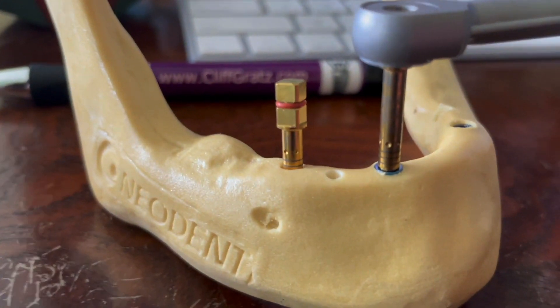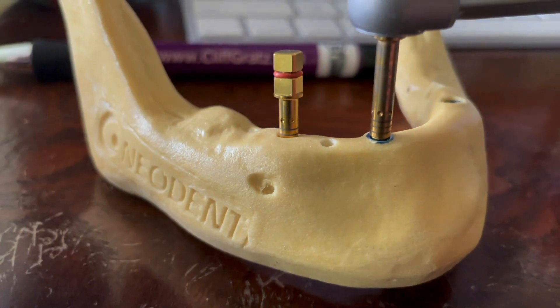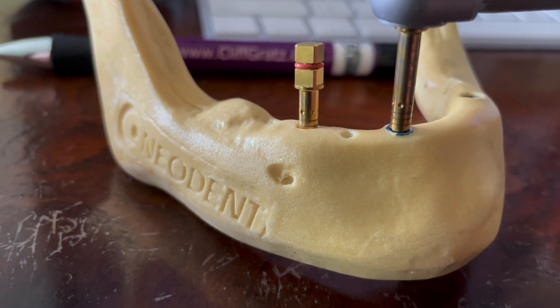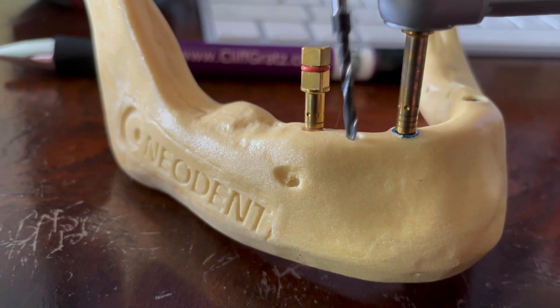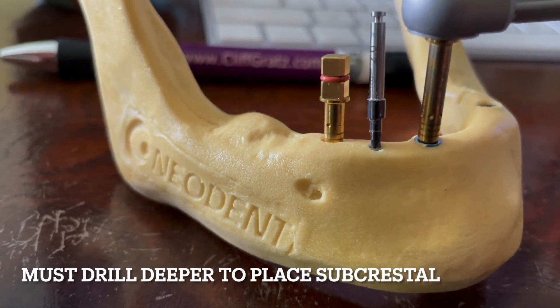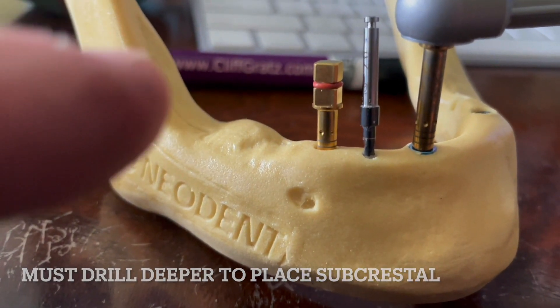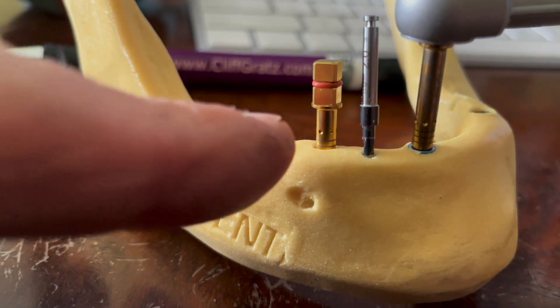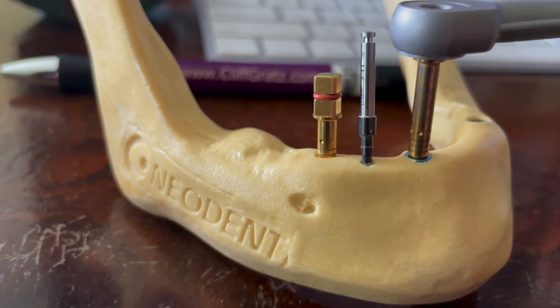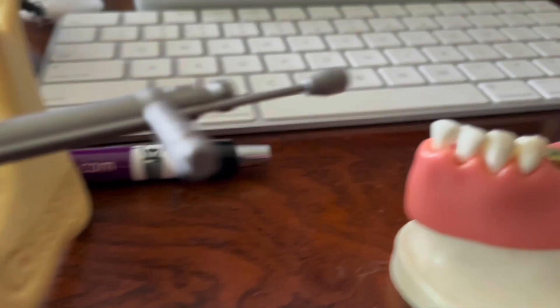Keep in mind, when we're talking about sub-level crestal placement, we've got to make sure that we're talking to our doctors about drilling a little bit deeper. So you see that goes to 13, but we're only placing an 11.5 length implant — very important. The other thing is think about restoratively.